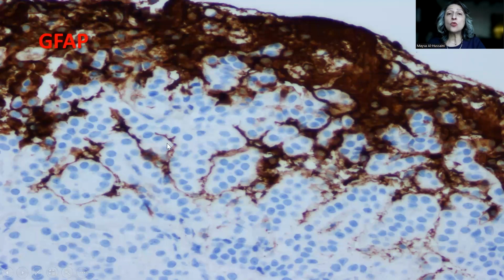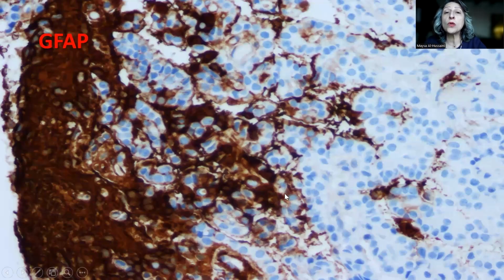However, what I would like to highlight and show you is the focal infiltration of the choroid plexus papilloma into the brain parenchyma here and here. And this is very important. Pitfall: invasion into the brain, unlike meningiomas, for example, does not change the grade of the tumor. So it's a feature that we can see in choroid plexus papillomas, in atypical choroid plexus papillomas, or even in carcinomas. Per se, invasion into the brain does not alter the grade of the tumor. This is extremely important to know.